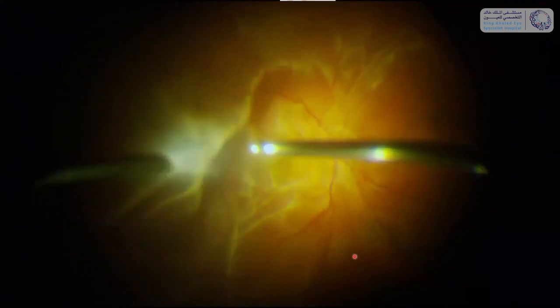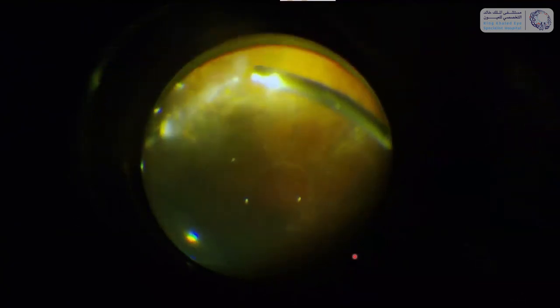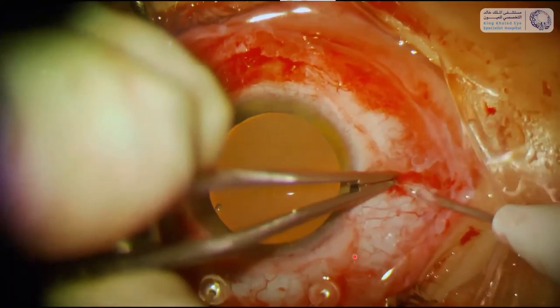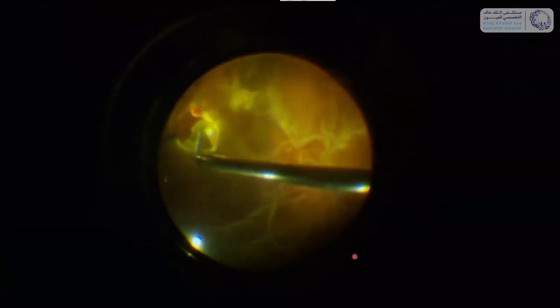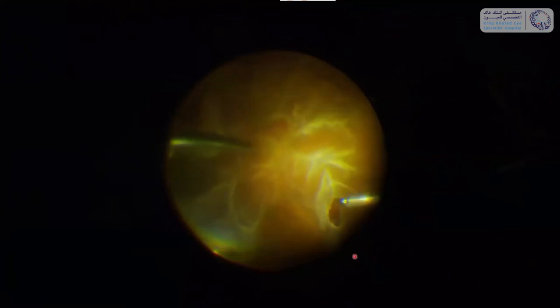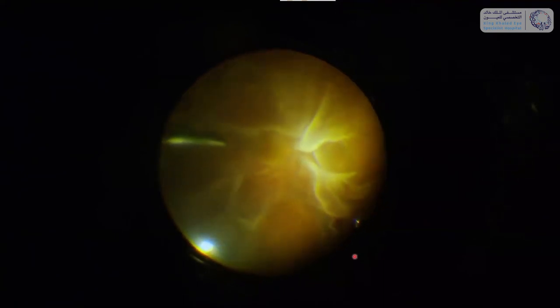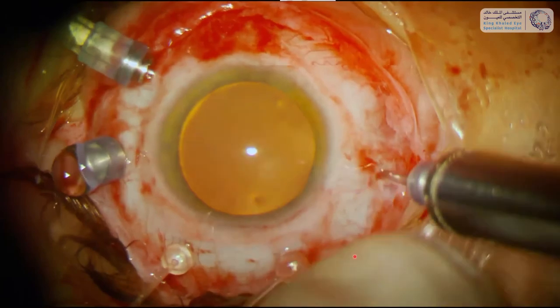We start by doing a vitrectomy — the retina is still attached so it's a little tricky. Here I'm injecting perfluorocarbon while holding a backflush instrument in my left hand with chandelier illumination. It was not so difficult to flatten the retina, also thanks to the buckle. Now I needed to remove the subretinal tissue, and for that purpose I'm using the DORC subretinal forceps — a 20 gauge forceps, so you need to enlarge your incision. It's a very convenient instrument which you can slide through a peripheral retinotomy under the retina to take the subretinal strand.